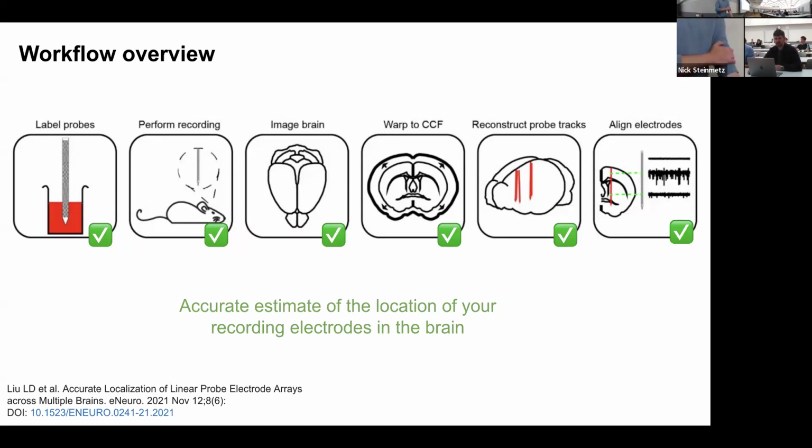Do you have any tricks and tips for working with multi-shank 2.0 probes? The question was about multi-shank 2.0 probes, particularly in the alignment step, or just in general: how to successfully understand where your shanks have been and how to tell the differences between the shanks.